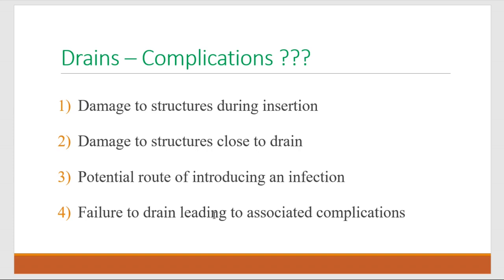Third, a long-term drain is there inside a patient and it is creating a potential route of introducing an infection. The patient is more liable to get an infection if the drain is placed for a longer duration, right?